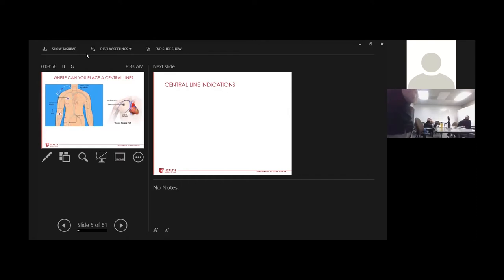We see a lot of femoral lines in emergency situations. It's not uncommon for people to do a femoral central line and a femoral arterial line at the same time in a crash patient. Some people call it the dirty. Get down there, do a quick and dirty prep, and do it all at once. There's nothing going on down there. There's a lot. So we see that a lot in our small facilities. I don't know if your experience is similar. That's my experience, yeah, for Rock Springs. Sick people in Rock Springs, they love this.